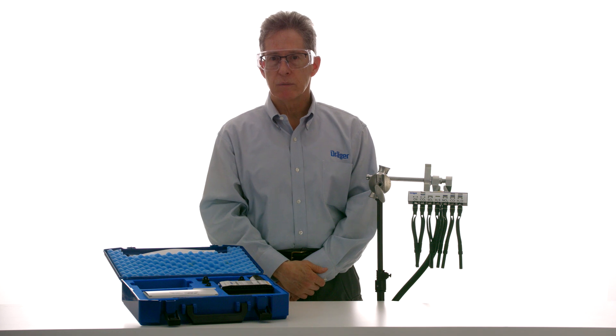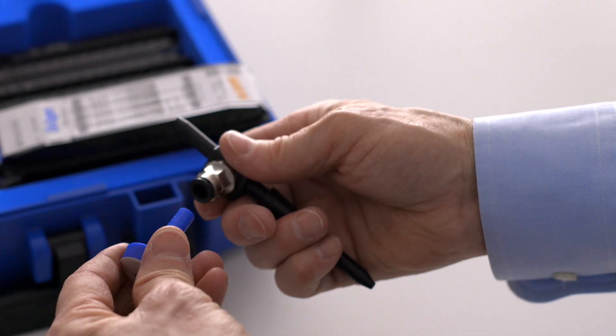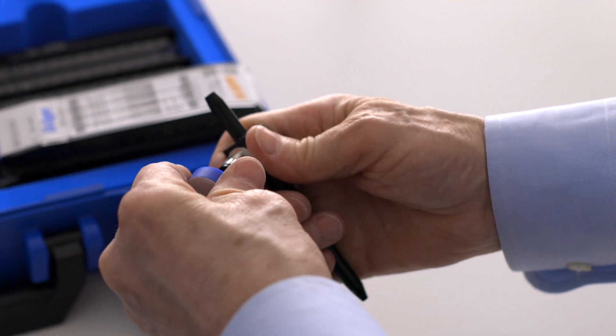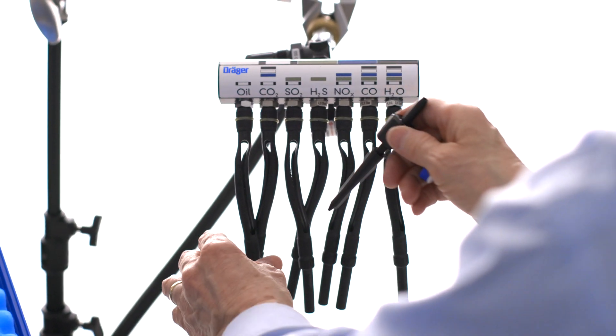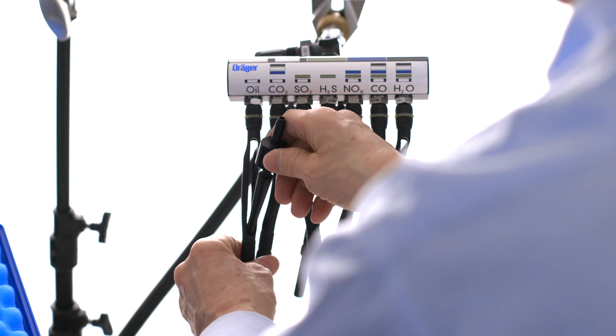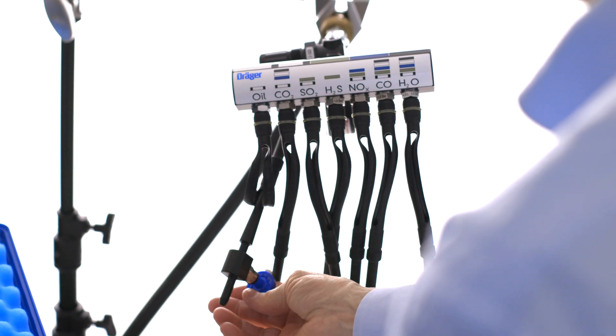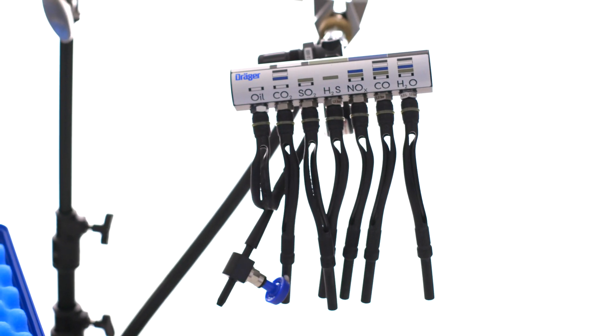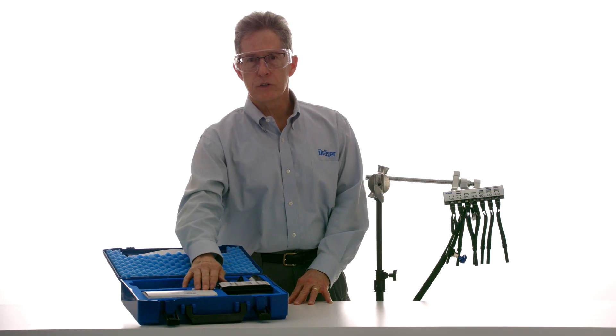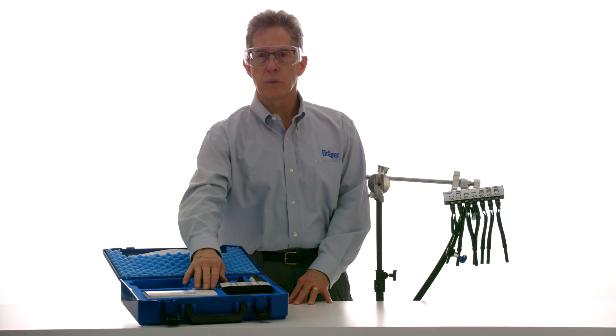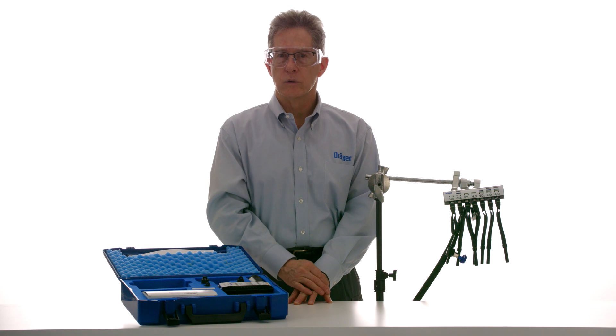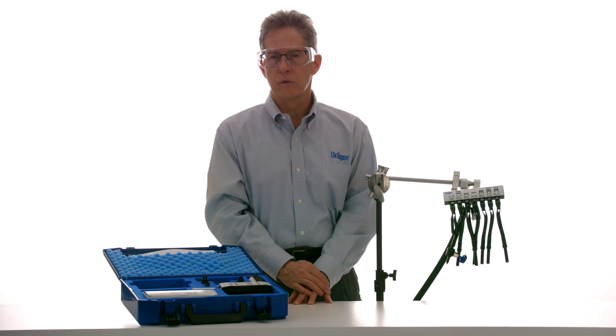Now we can start the preassembly of the impactor and the tubes. Attach an oil impactor to the impactor adapter. Insert the adapter into the bottom of the holder designated for oil. Leave the top hanging for now. Drager replaced the oil tube with the oil impactor some years ago because the impactor displays mineral oils and synthetic oils independent of the oil type or viscosity.